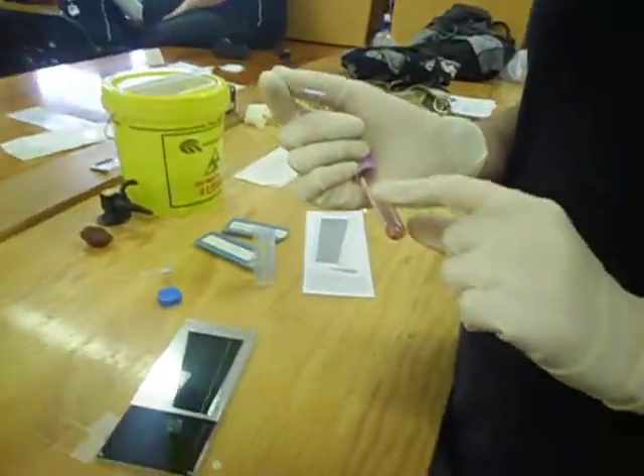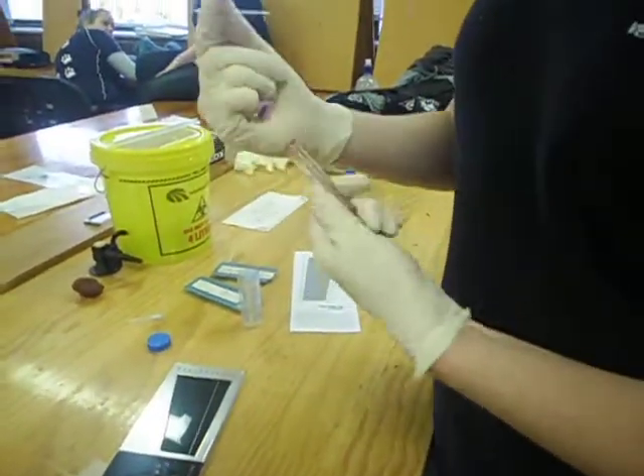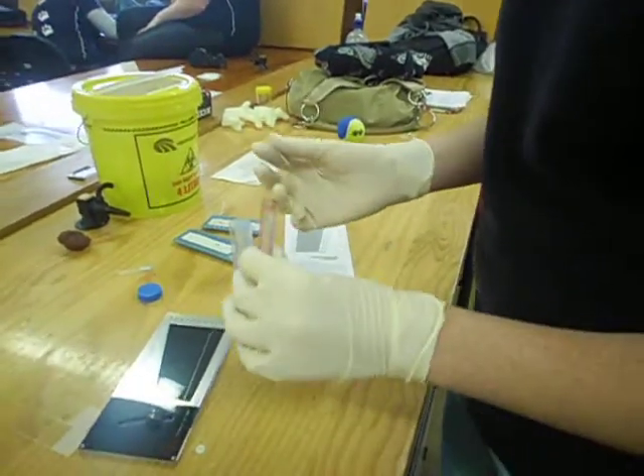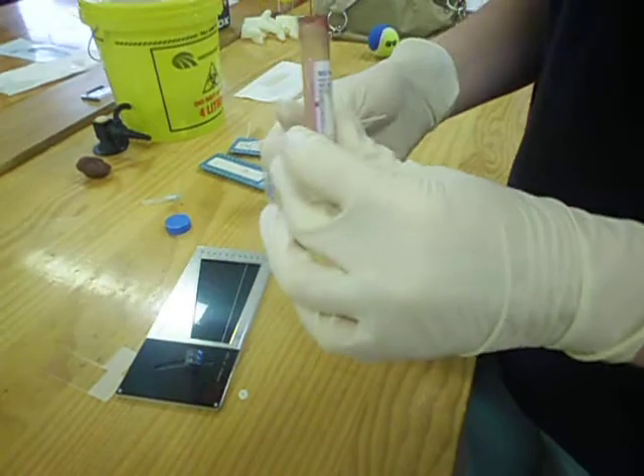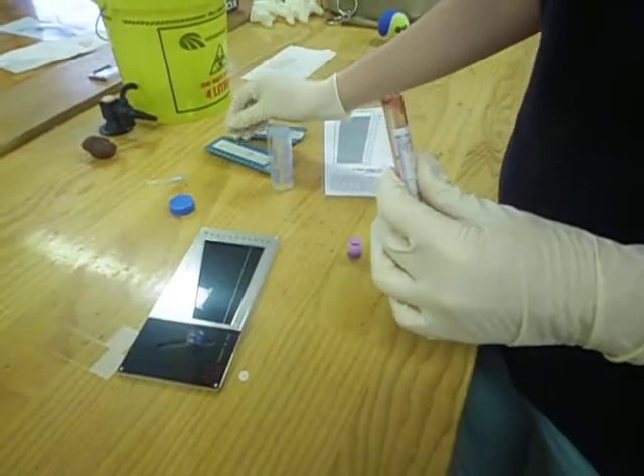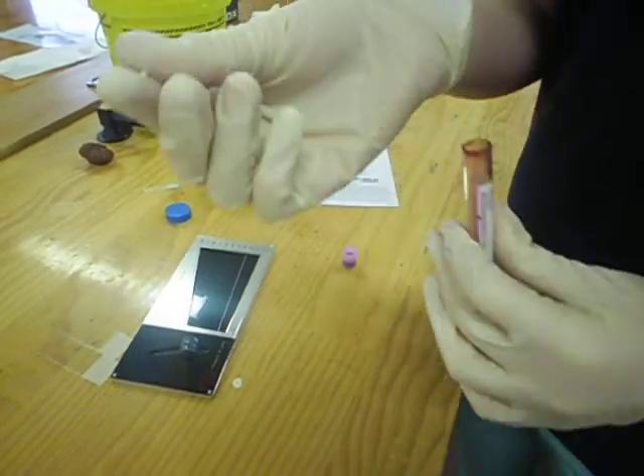So if we had blood left, I'd put it in the blood, roll it until it sucks it up, and then I'd clot it, like that.